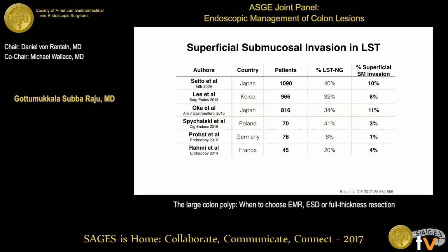I want to summarize a beautiful editorial by Doug Rex. Actually, this is his table. And this came in, I think, last month, GIE, Mike? So I encourage all of you to read this. It's a beautifully written editorial. What it tells us is, because there's a lot of debate, should you do EMR or should you do ESD for lesions that can be resected by endoscopy?